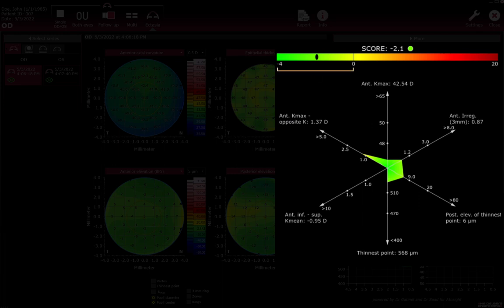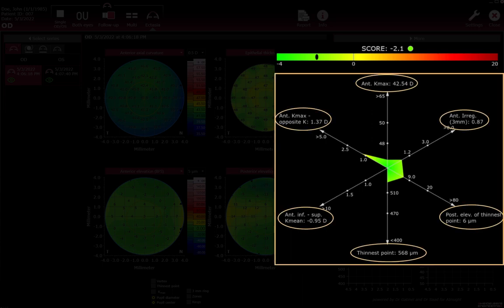A score value below zero indicates not to very low probability of ectatic changes and is assigned the colour green. A score value of zero and higher is an indicator for possible ectatic changes — the higher the value, the higher the probability of ectatic changes. Score values of zero and higher are assigned to the colour range yellow to red. The radar map shows six corneal indices suspected to be indicators for corneal steepening, corneal thinning, or both, such as in ectasia.